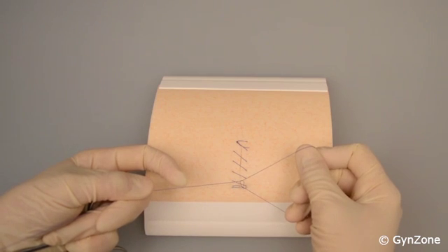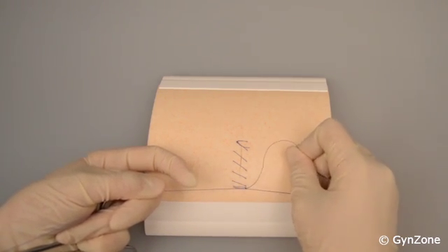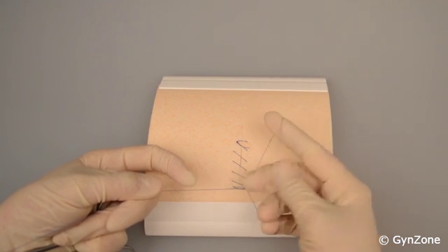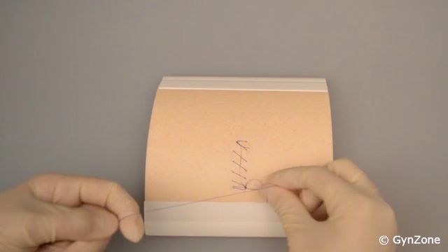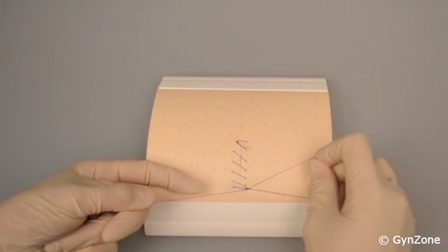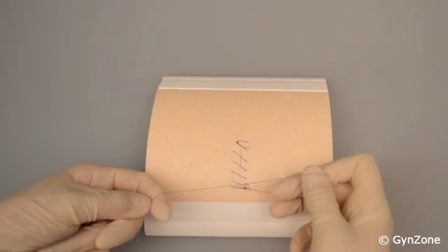The original loop formed by the finishing stitch is tightened by pulling on the part of the new loop connected to the original. Repeat this until you have made three loops in addition to the original stitch.